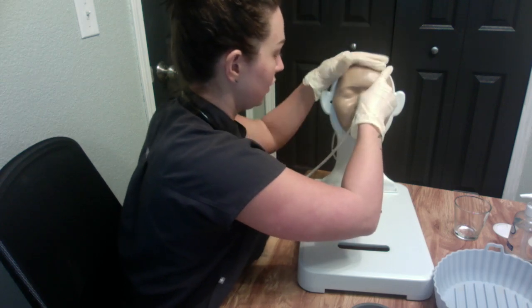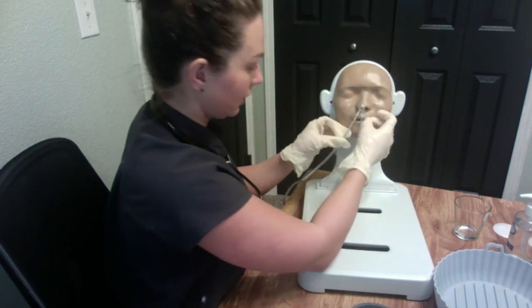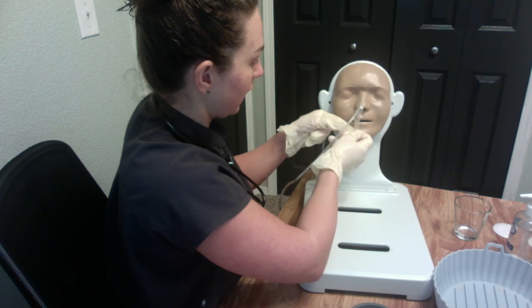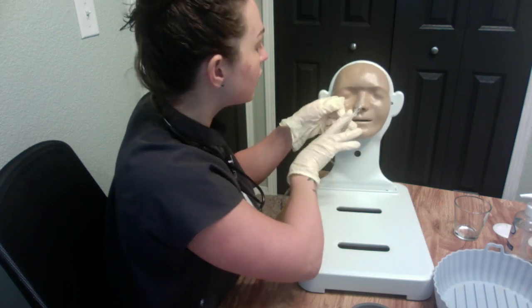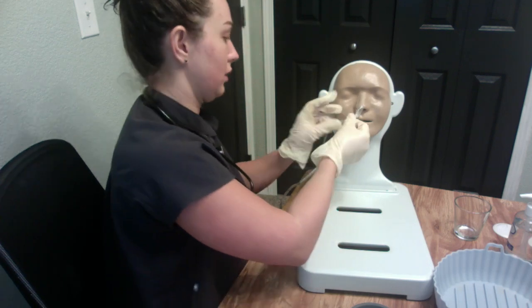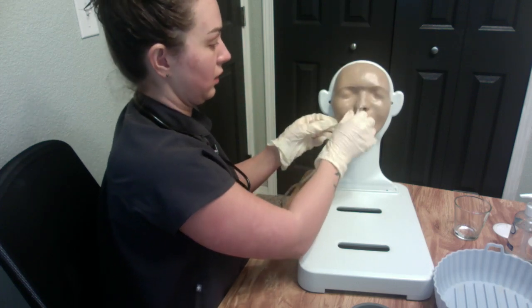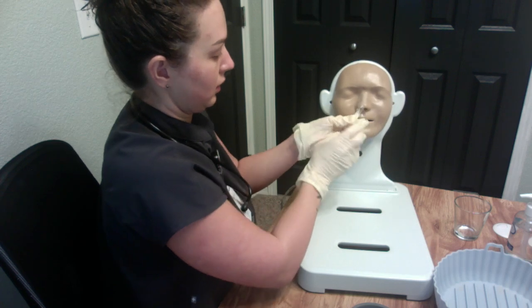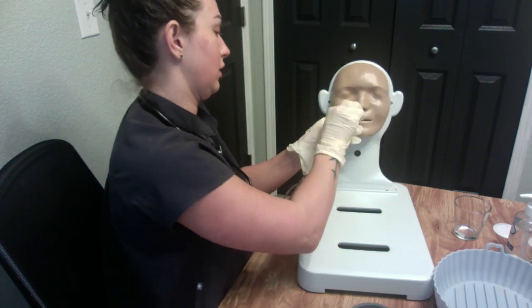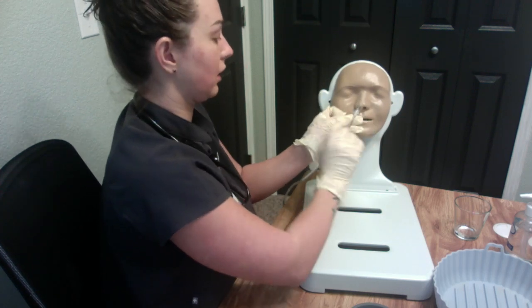We might use some skin adhesive to help hold that in place if needed, but for right now we're just going to do tape. My tape is not wanting to stick.